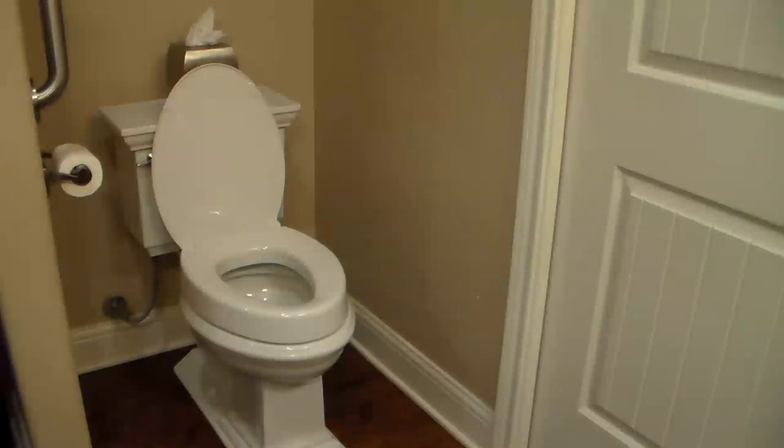Today we're going to install a raised toilet seat. This is a three-inch extension in height and it'll be very handy for anyone recovering from surgery, has mobility issues, or if you just have an older-style toilet and you'd like to raise it up a little bit. It's a very economical way to do this without replacing the toilet. Let me show you the easy steps on how to make this happen.